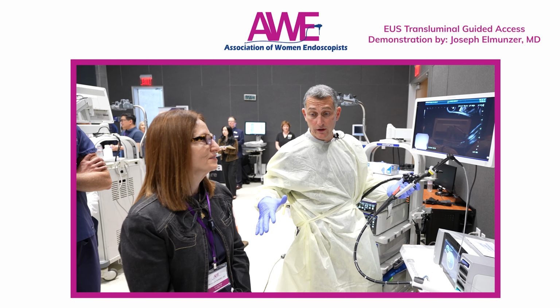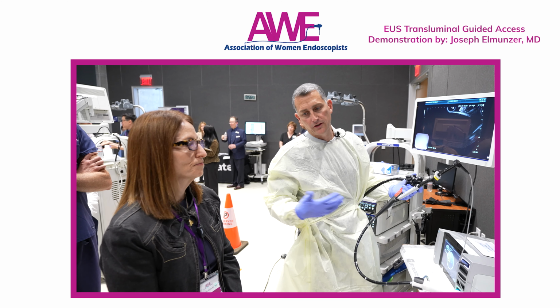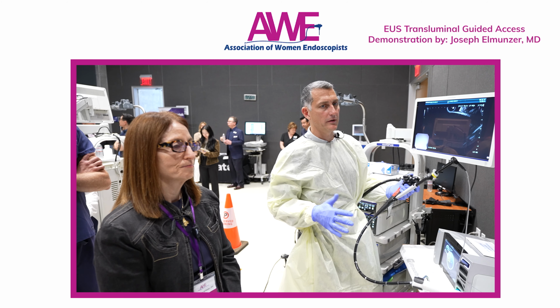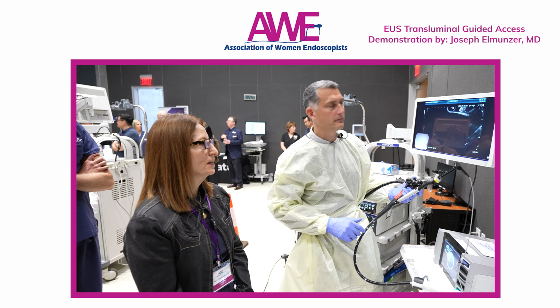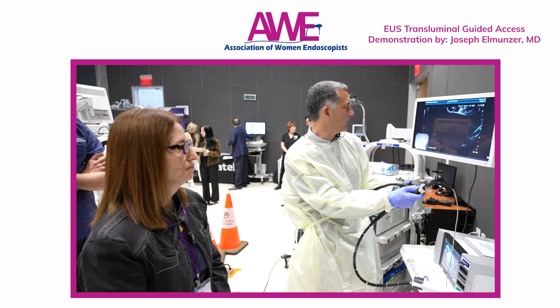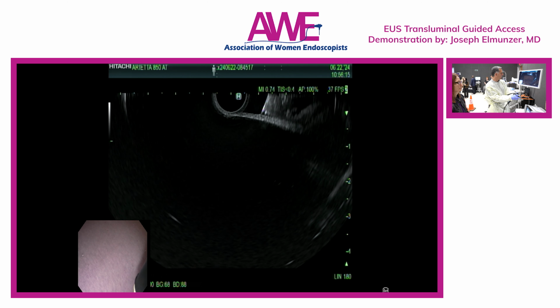Now, we have more latitude now that there are different sizes. So with the 6 millimeter prosthesis, for example, we might be able to puncture a really small target. But I think the number one reason for maldeployment is that there's not enough working space within the target. Absolutely. So just moving forward, we're going to advance the tip of the catheter until it sort of tents the target wall.